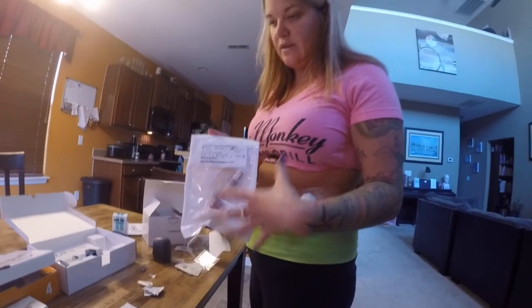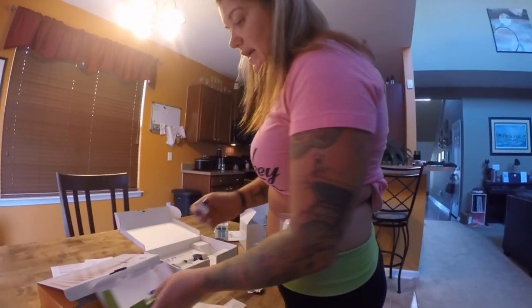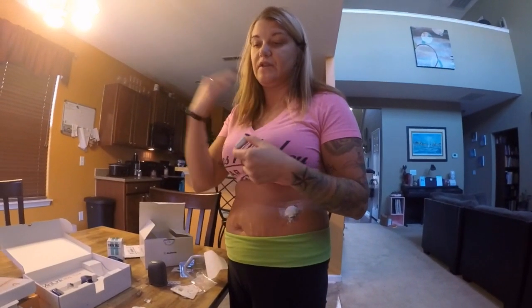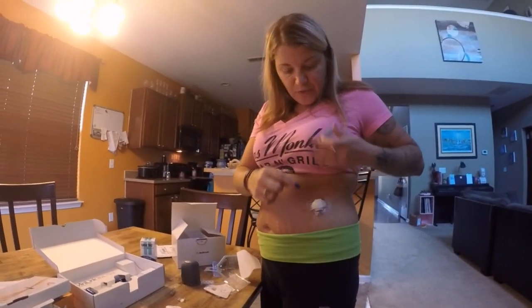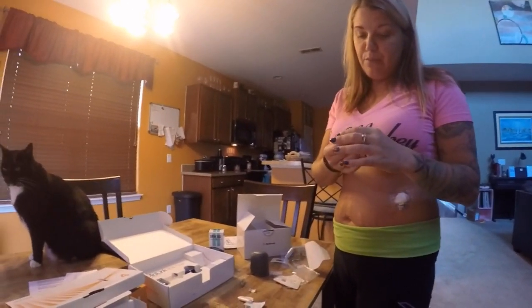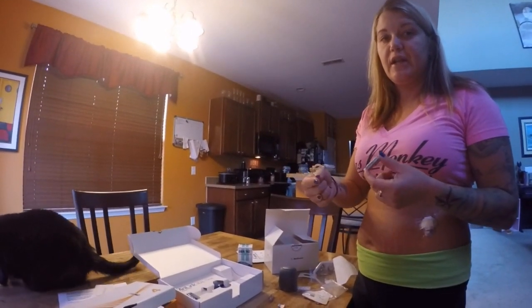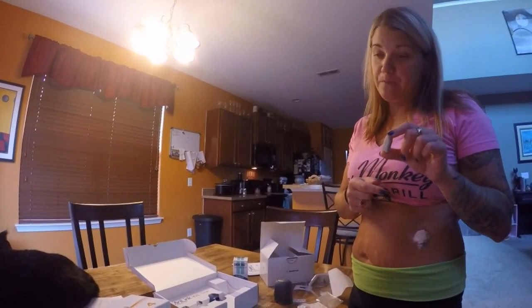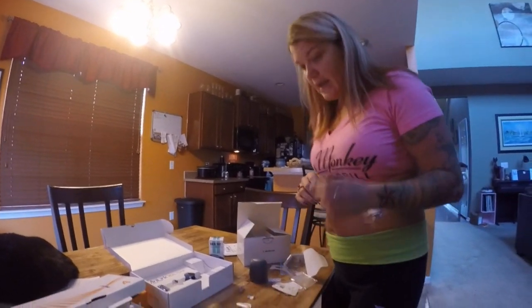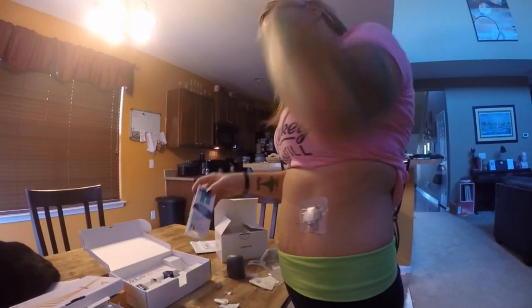The Dexcom G5 sensors come in packs like this, already self-contained and ready to go. The transmitter comes in its own box — it lasts three months and then you need a new one. One thing I've learned, not recommended by Dexcom, is that once the seven days are up you can say you're putting in a new sensor and restart it. I've had them last a full month, which saves money, and the accuracy stays great the whole time.